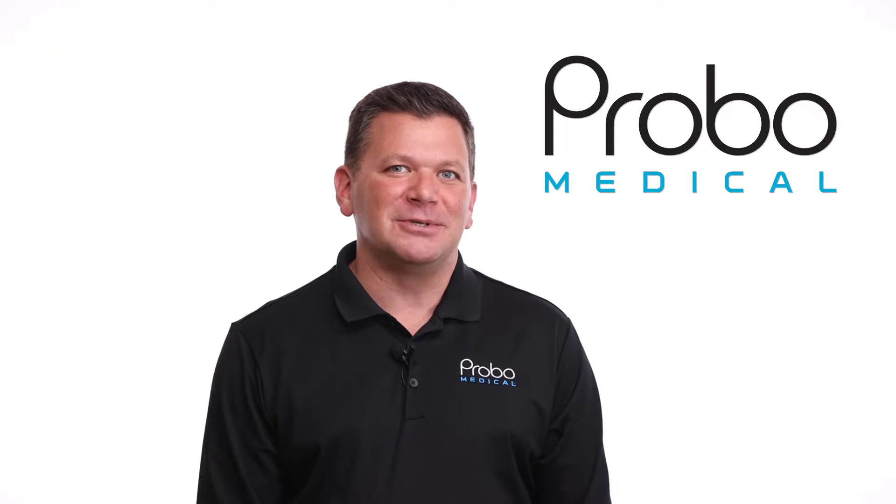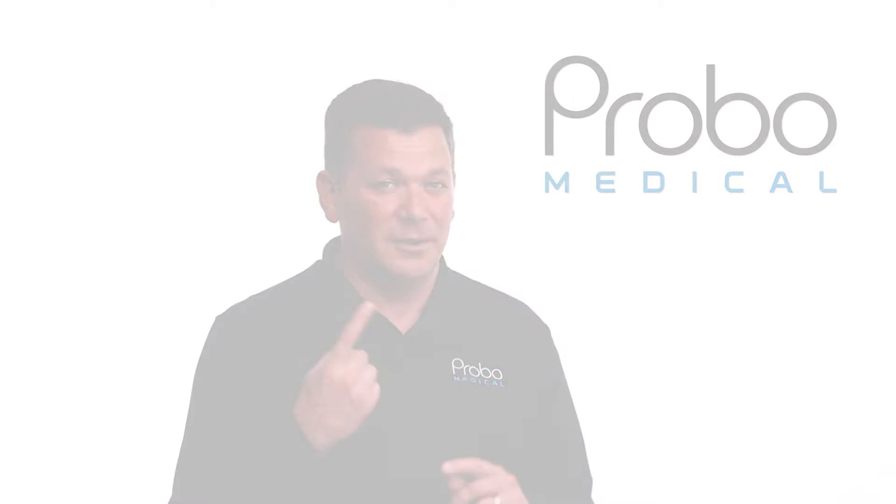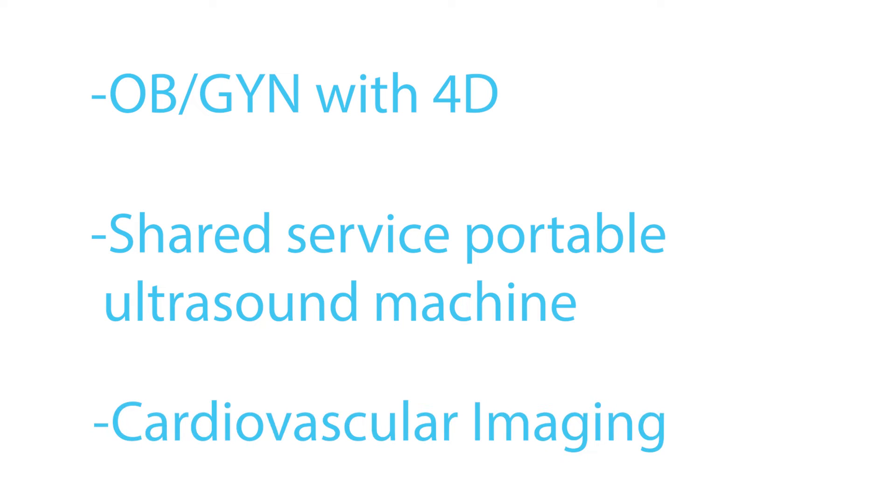There are three likely reasons you'd be interested in this ultrasound system: you'd be looking for a premium portable system for OB/GYN with 4D, a true shared service portable ultrasound machine, or cardiovascular imaging.